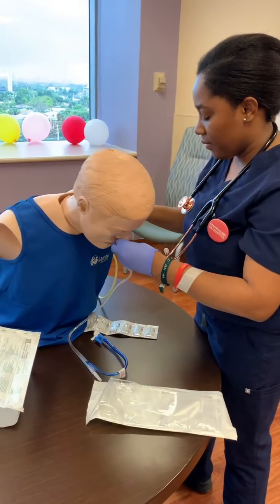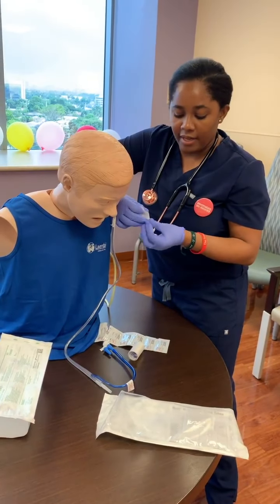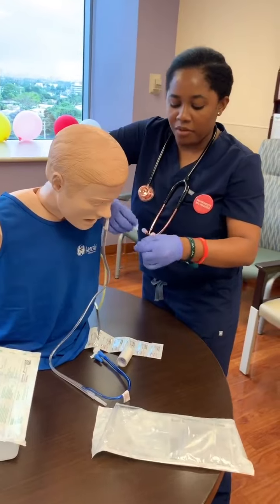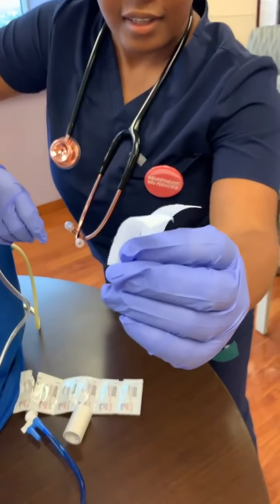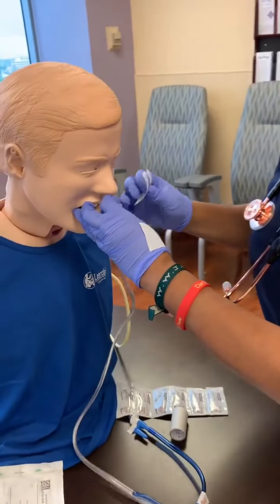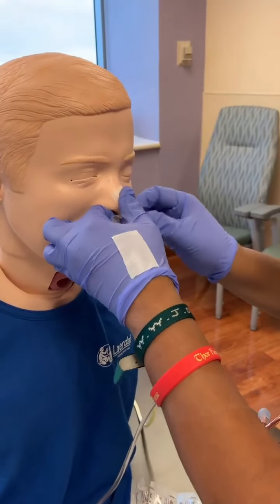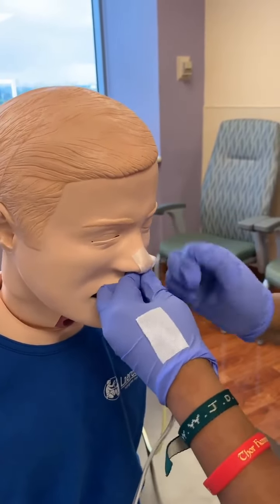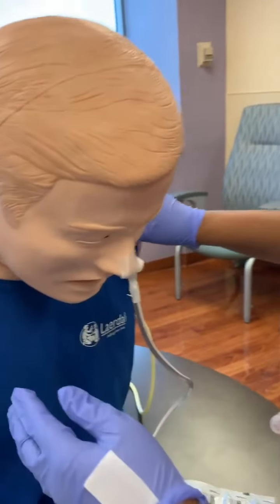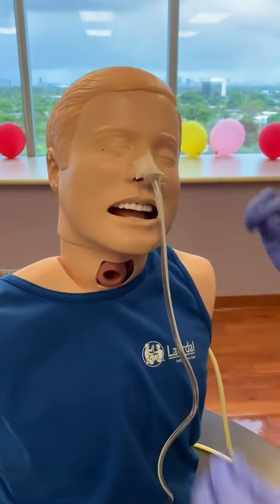So what we should have done is have a piece of tape already ready — just note that you'll be doing that before you actually insert your tube. What we're going to do is create a little slit in the tape, then go ahead and put it in the nose area, and wrap the tape around the actual tube to help secure it and put it in place. You can probably add a little bit of extra tape in the nose just to help secure it even more.